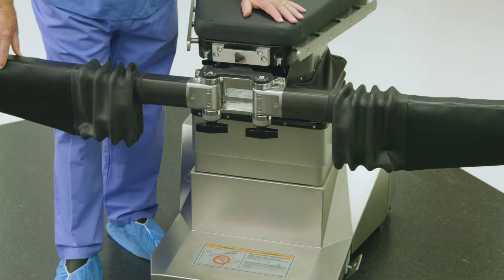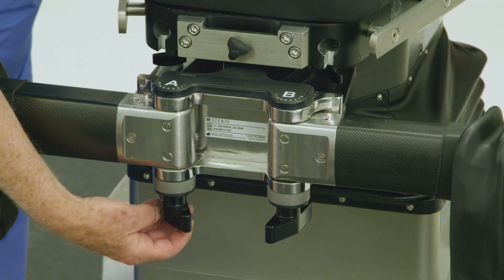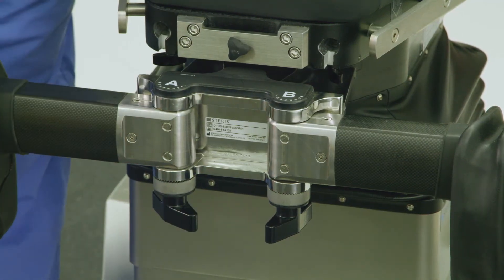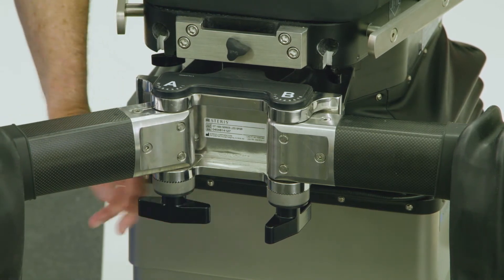To position the abductor spars for anterior approach total hip arthroplasty procedures, loosen the knob below the A rosette and set the A joint position to 6 or 7 for wide-hipped patients. Relock the A rosette handle.